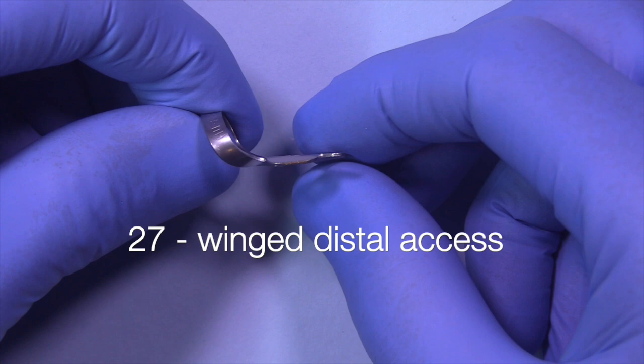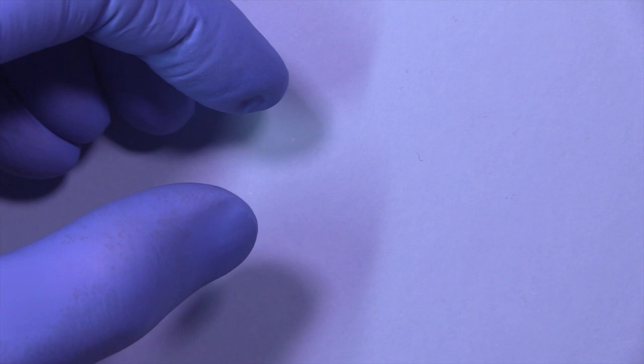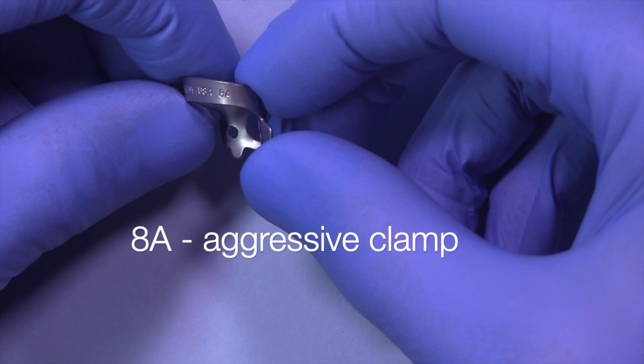Then finally I have here the 27. This is a winged distal extension access clamp that I would place after the rubber dam is in place. Sometimes it requires you to swap out the distal clamp with this particular clamp, but it's a fantastic clamp and we'll show you how to use that.